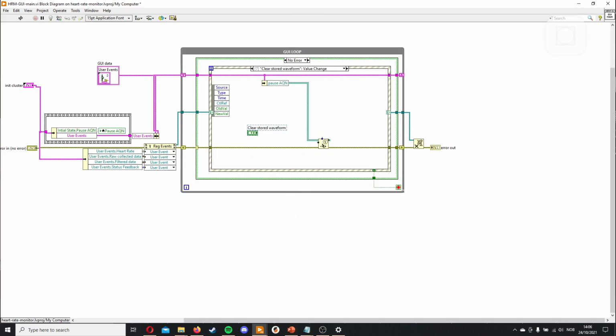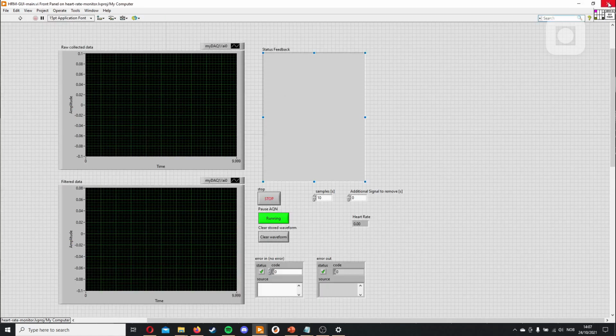We could send anything in here because we will never send don't clear waveform. If this signal comes through, we will clear the waveform. But we'll just add this here because it will error if we don't have it. And we remember to change it here. So now, when we press the button, it will send a signal on the clear waveform user event.